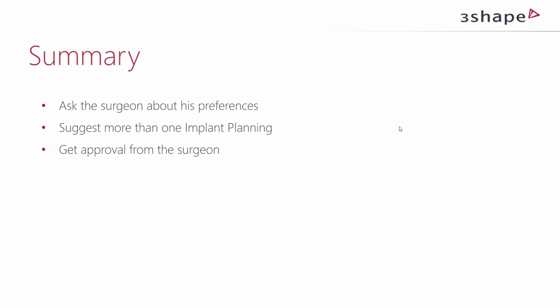Then there is a question on how can a lab technician know about what surgical kits a given surgeon will use with Implant Studio guides. I think, Jan, you mentioned a little bit that it's important that if the lab is involved in this, that you talk about these things, because if the surgeon places an implant with a given sleeve in there, maybe he did it by accident, maybe he put the sleeve in there by accident, you know, he didn't think that he was supposed to decide on a given sleeve, and ultimately you can say the sleeve actually decides on what options you have for the surgical kit that he's going to use.